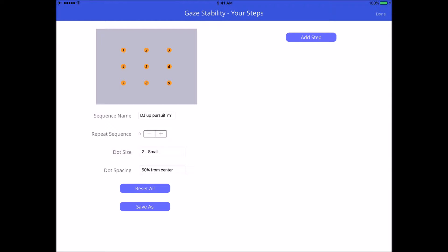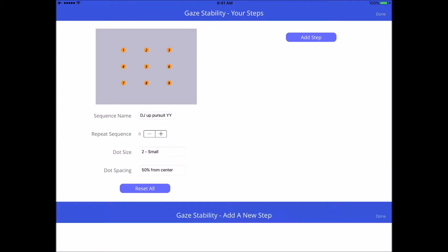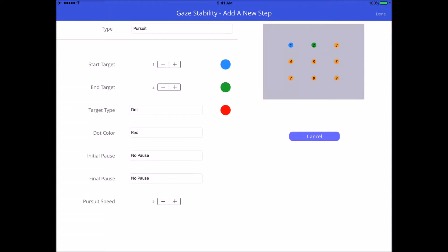Let's go ahead and create the first step. When you add step it takes you to a separate page. A step will be from any one of those nine locations or nine dots to another. For example, I want to start in the center at number five and I want to do a gaze exercise strategy to go from center to the right, so I'm going to make my next target number six.